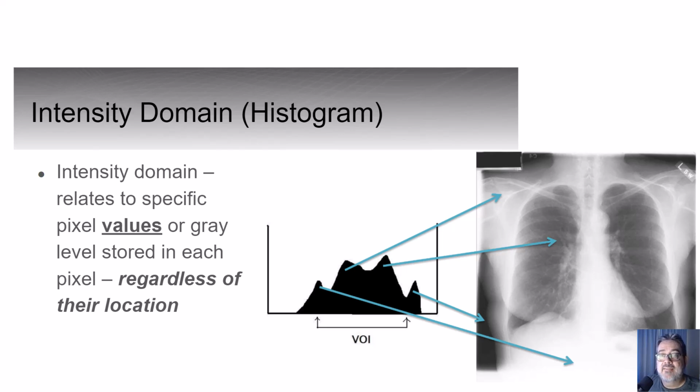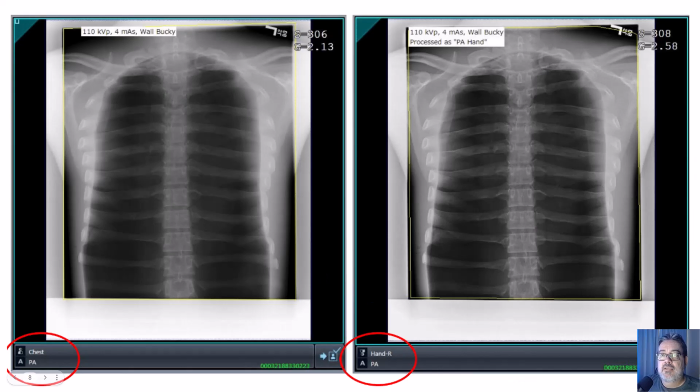The y-axis, or the vertical axis, represents the number of pixels representing each shade of gray. An anatomical lookup table is part of the processing algorithm that gets applied to your image data. To take the chest X-ray algorithm example, the lookup table is a sample of what a histogram for a good chest X-ray looks like, and the software will adjust the actual image to appear similar to the lookup table's distribution of values in the histogram.